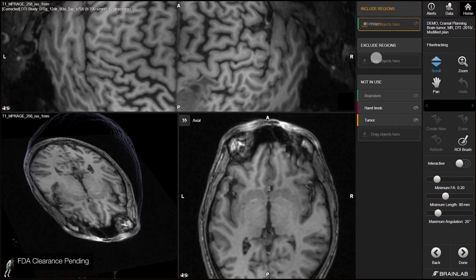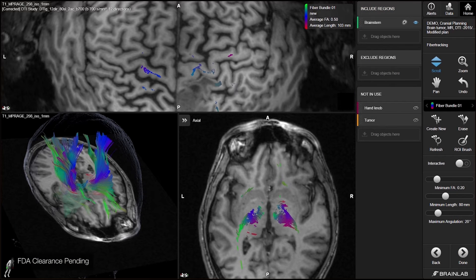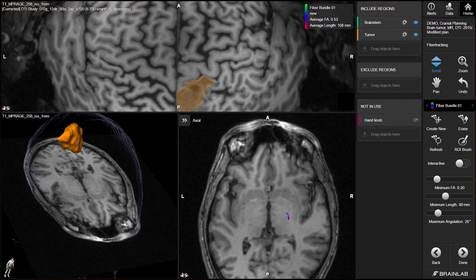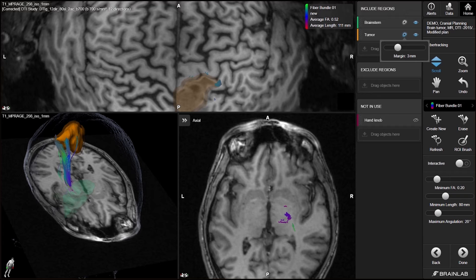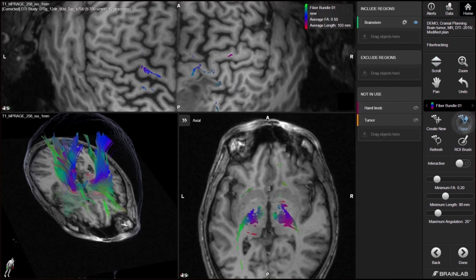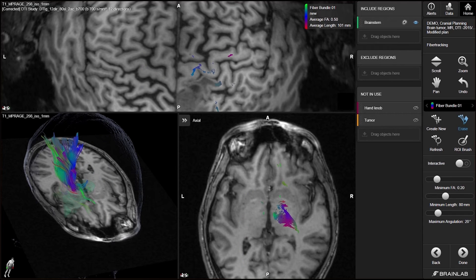With fiber tracking, traditional object-based tracking is optimized through drag and drop selections with instantly updated results. It is possible at any time to also erase fibers both in 3D for larger bundles and 2D for more precise deletion.